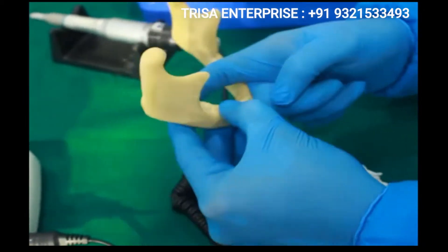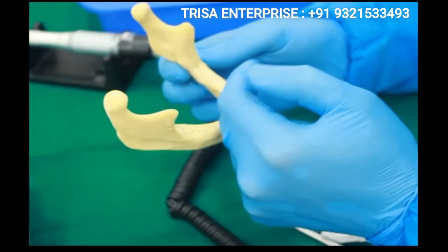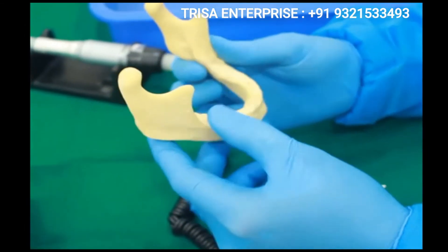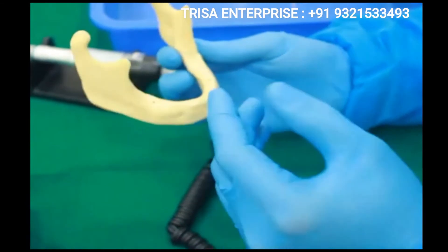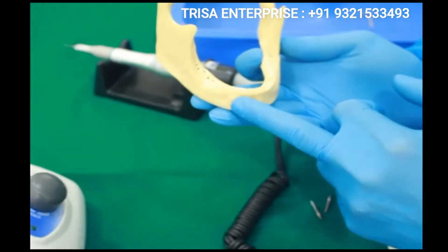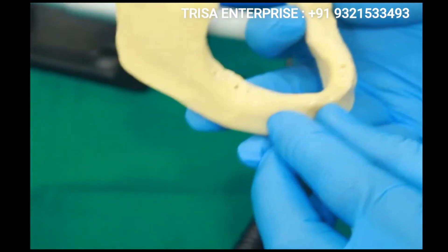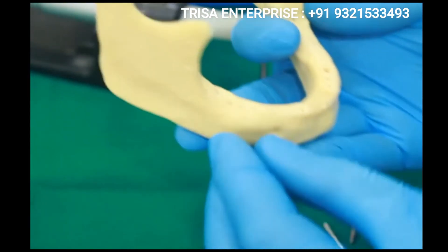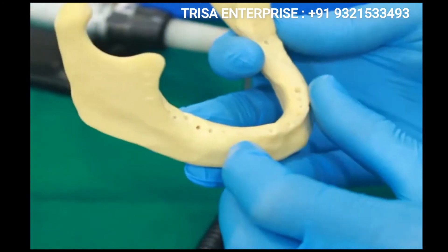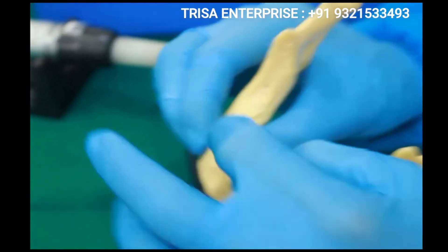Whenever the patient comes for examination, you ask them to open their mouth. Just palpate — as you see with a complete denture — and if you feel there is an undercut in the posterior mandibular area, we can definitely do a lingual cortical engagement. To identify the posterior mandibular area, run your finger in the vestibule and you will feel the mental foramen exiting buccally. Anything behind the mental foramen is the posterior mandible, and anything ahead of it is the anterior mandible.